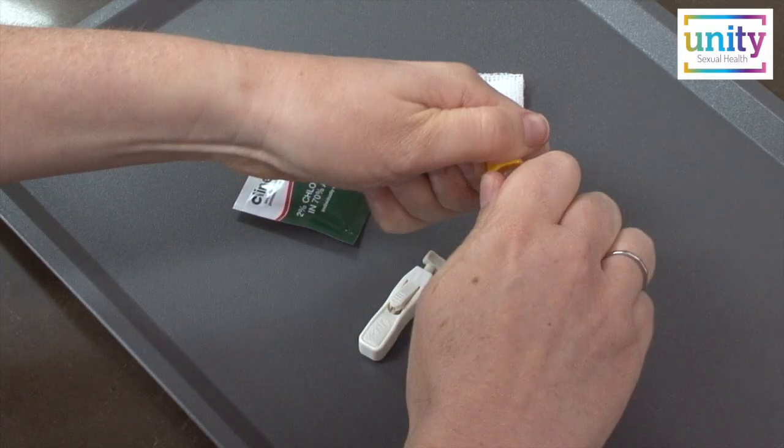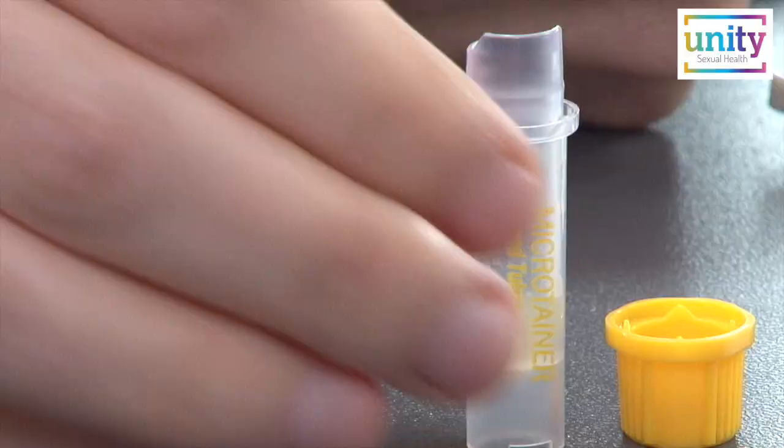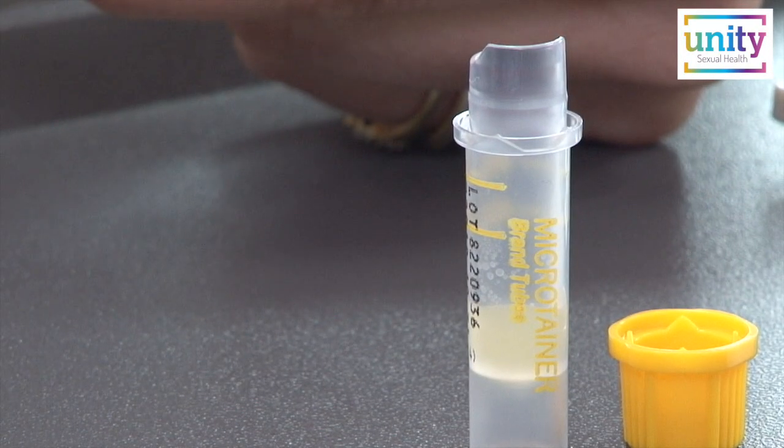Take the lid off the specimen tube and place it upright on a flat surface. Be careful that no gel is spilled from the specimen tube.